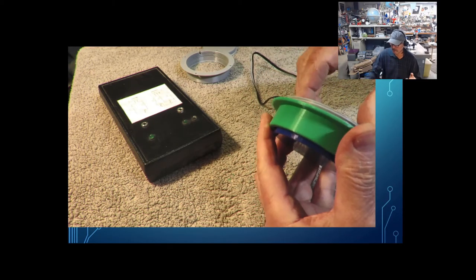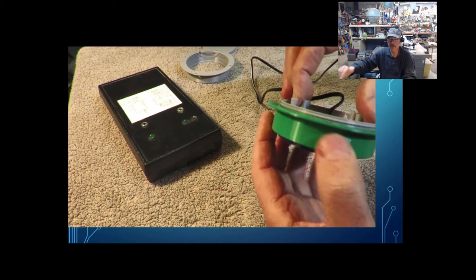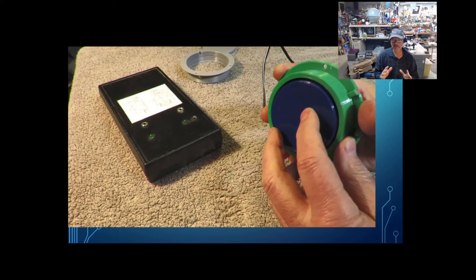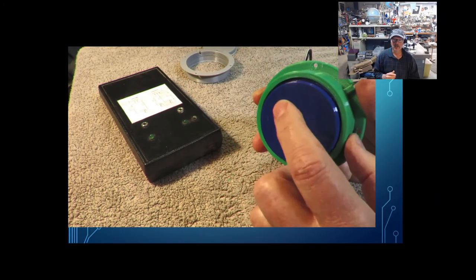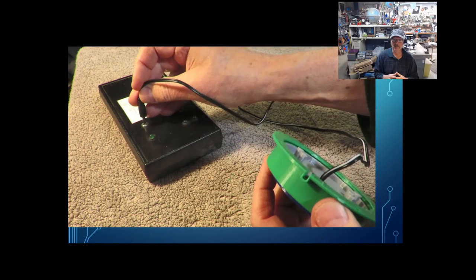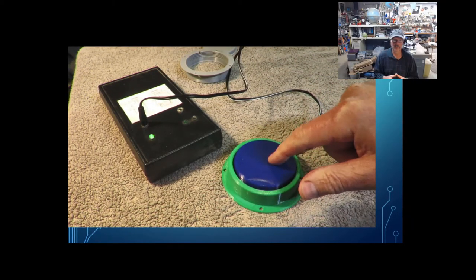Now, it is possible to thread this so tight that you'll activate the switches. You should be able to feel a little clicking every time you push it. If there's no clicking, you've got it too tight, so back it off a little bit. Once you're done with that, a little hot glue. I always test it at this stage anyway to make sure things are working fine.